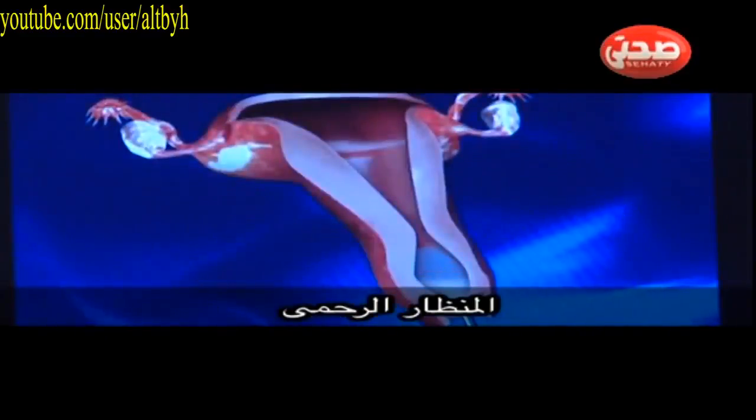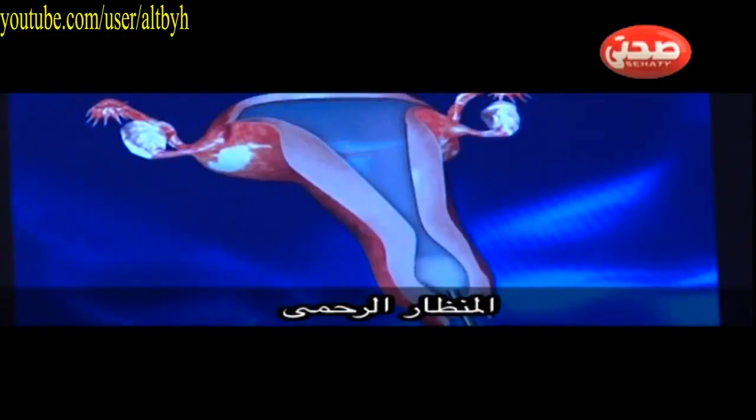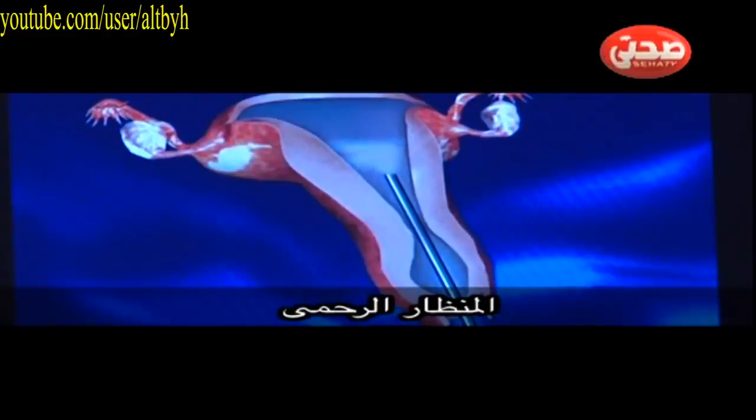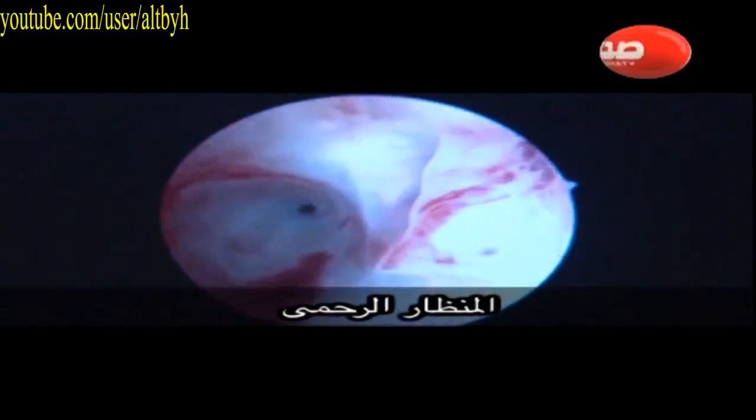So this is the insertion of the hysteroscope, and this is an illustration of how it looks with the distending media when you look inside, and the media distends the cavity, and you can see the cavity inside.